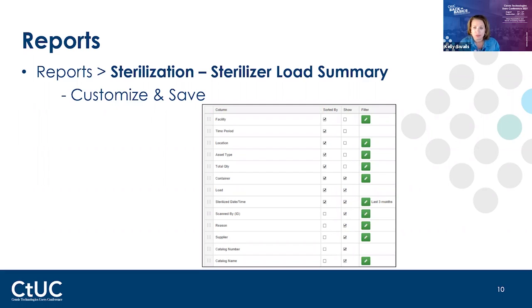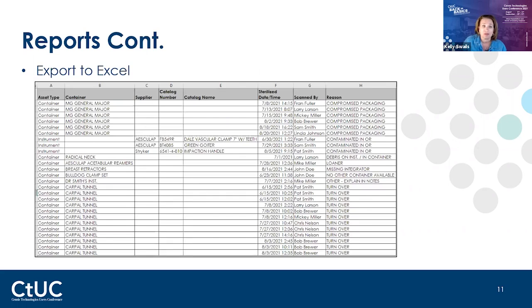And then if you do want, it'll save to that 3 months. So I'm looking now for a year. I'm just going to click on edit from that actions tab, change my time frame, and then there we go. So it's always there. And then when you do this, you run your report, you get that information. I recommend then exporting it to Excel.